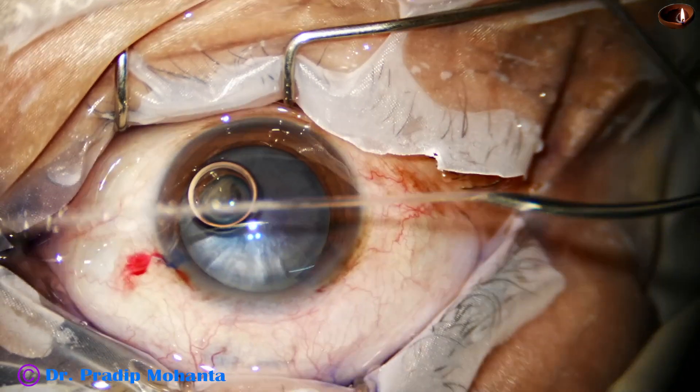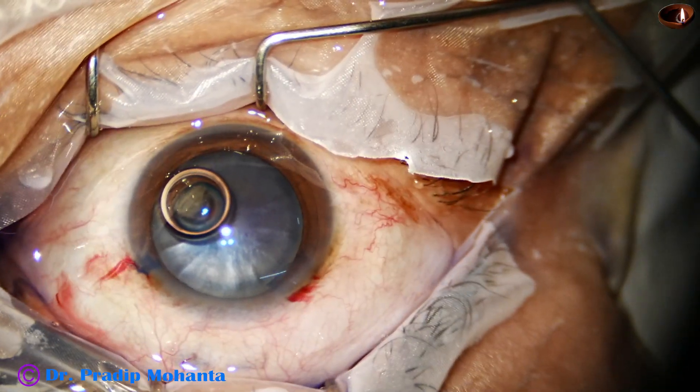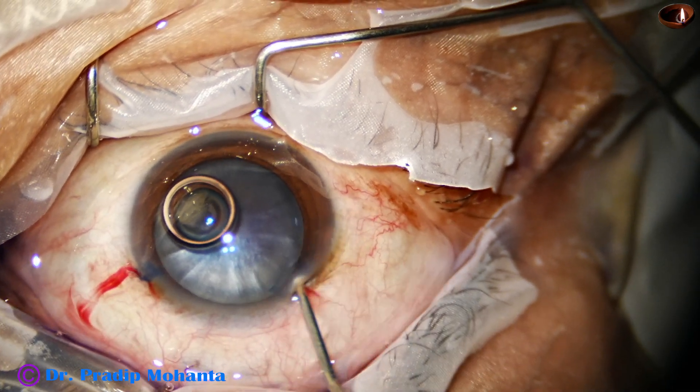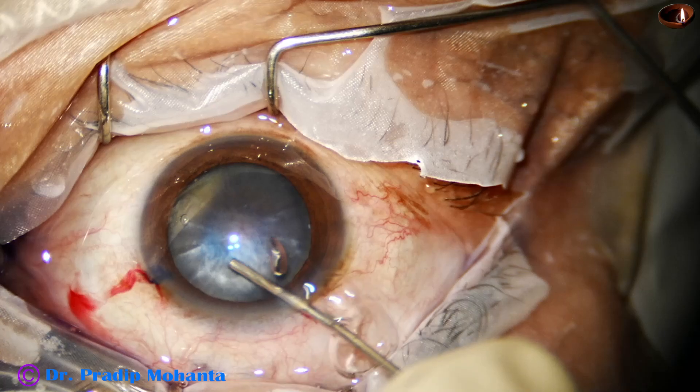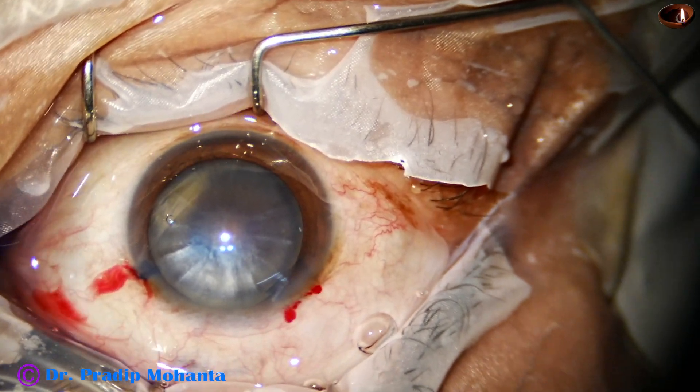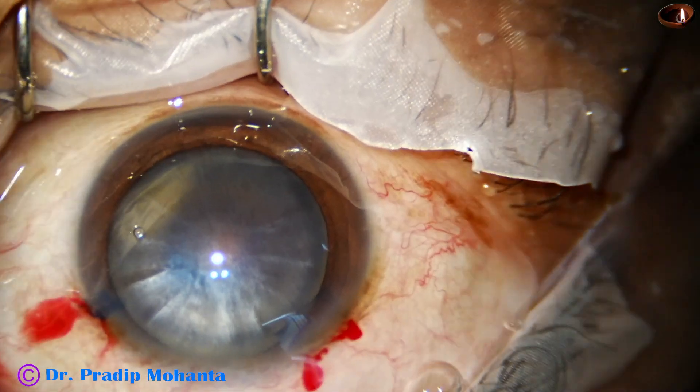And now the anterior chamber is filled with 2 percent hydroxypropyl methyl cellulose. Now it is time to do capsulorhexis.